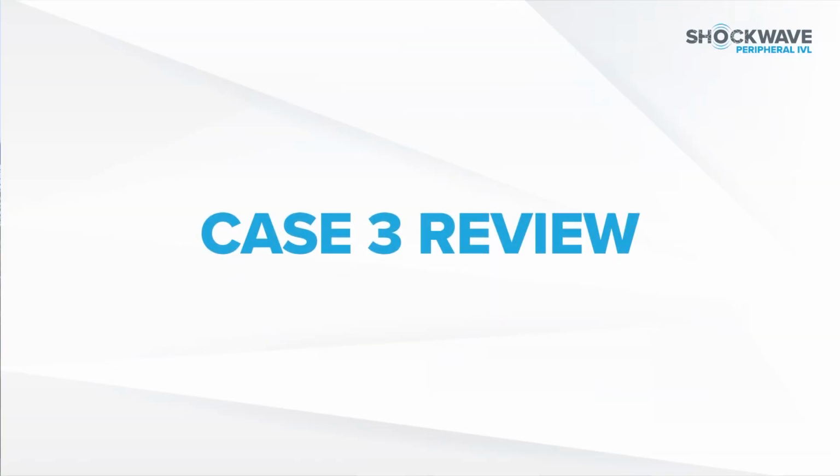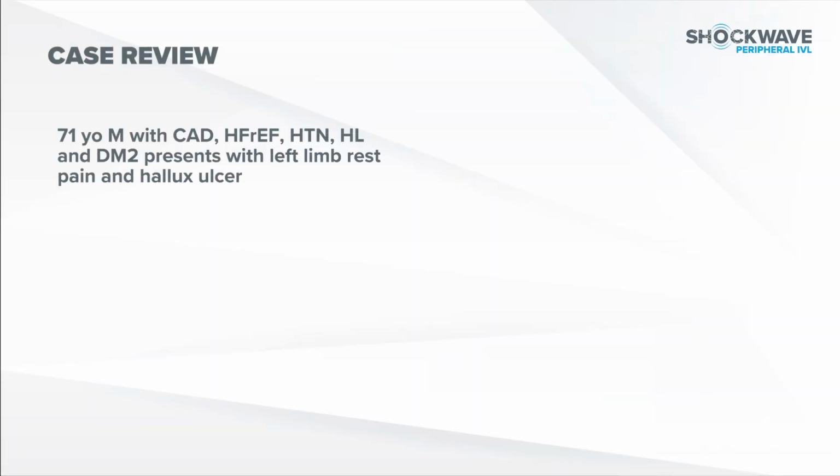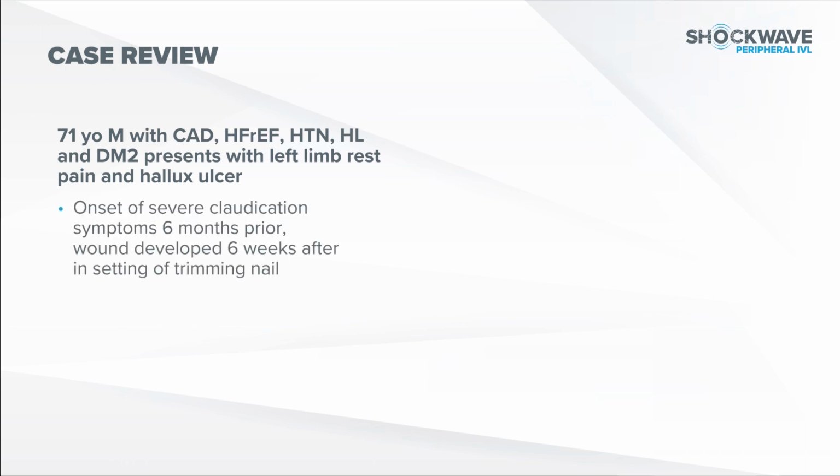I'm going to go a little bit lower now. So we did 2 great iliac cases. This one's a popliteal and a distal tibial vessel, and this is a gentleman I took care of. I kind of have an agreement. A lot of our podiatric surgeons do our minor amps and TMAs, and they get a lot of referrals for amputations, and we have an agreement that if an endovascular or surgical revascularization treatment wasn't attempted, they call and at least let us consider it before they do something.